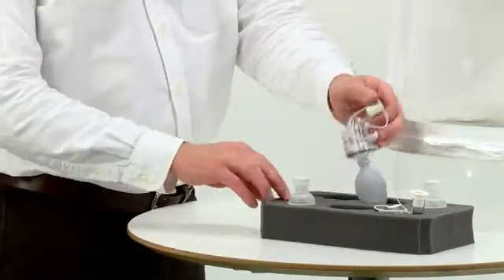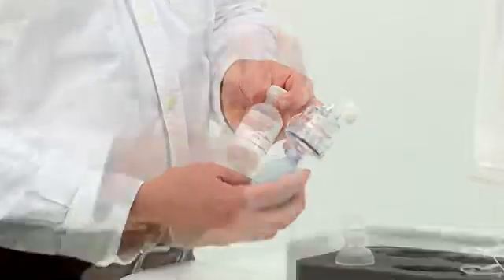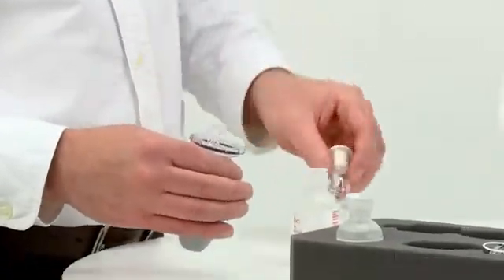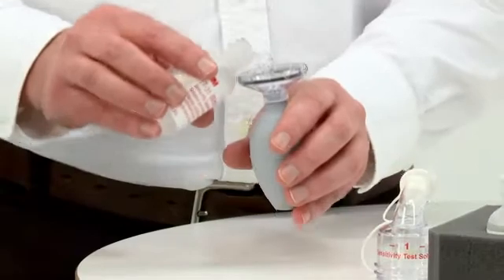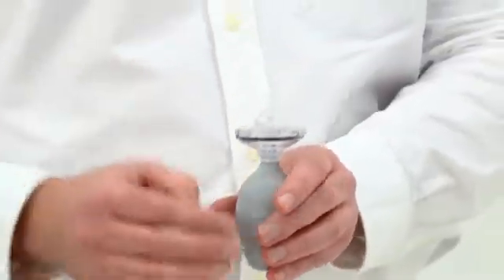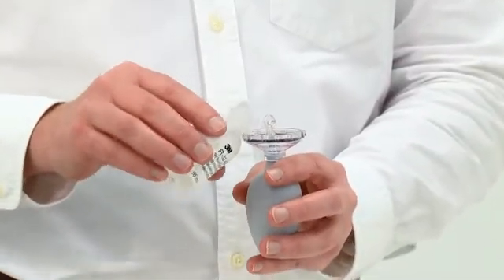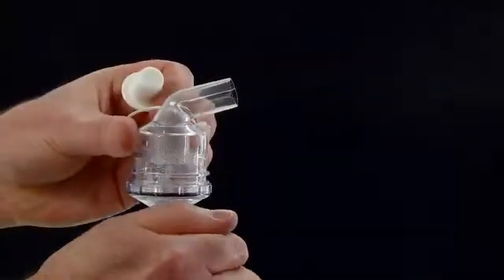The complete test breaks down into two parts: the sensitivity test and the fit test. Firstly, unscrew the nebuliser labelled Sensitivity Test Solution and pour in approximately one teaspoonful of the Sensitivity Test Solution. Next, pour a similar amount of fit test solution into the second nebuliser. With both caps removed, squeeze the bulb to check the nebulisers are producing a mist. Confirm that the test subject has had nothing to eat or drink except water and has not chewed gum during the 15 minutes before the test.